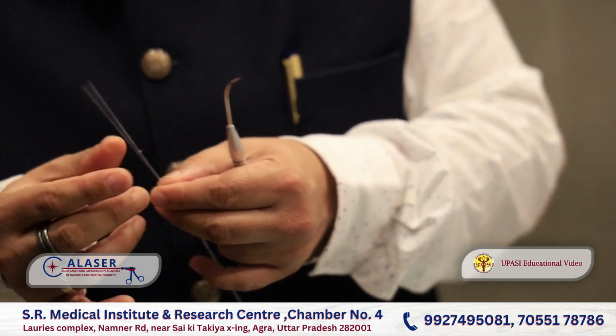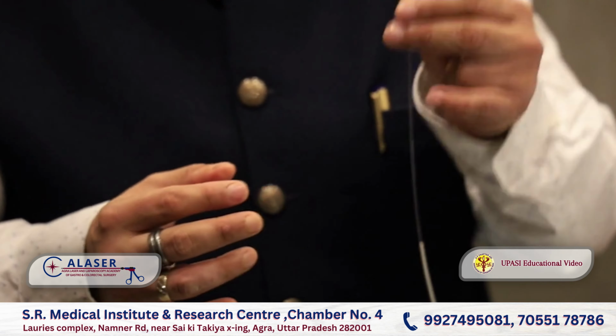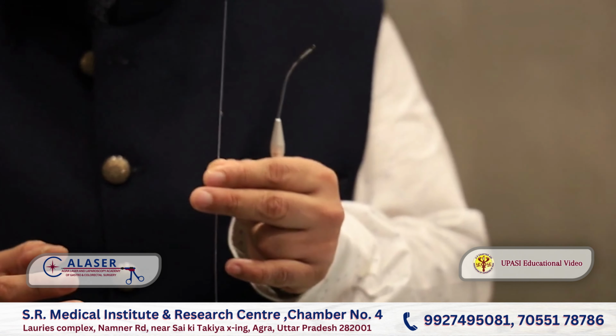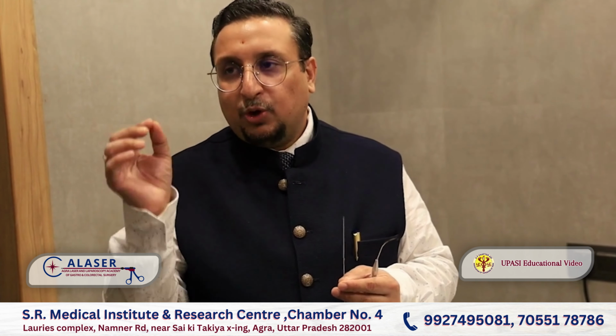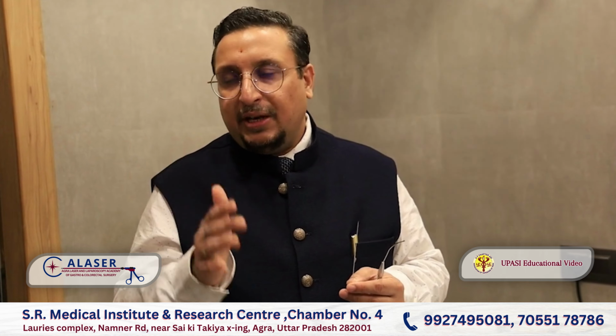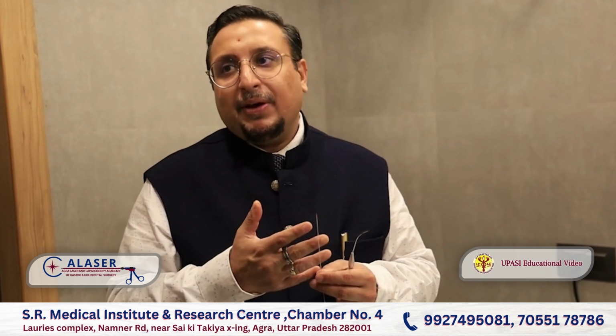The beauty of this bare fiber is you can cut it a number of times. So this can be used in 250 to 300 cases. My single bare fiber has been working for the last 2 years. It has not been finished yet. Generally, it is recommended that piles should be done with a conical fiber, but the life of the conical fiber is very less. So we are doing with the bare fiber also.